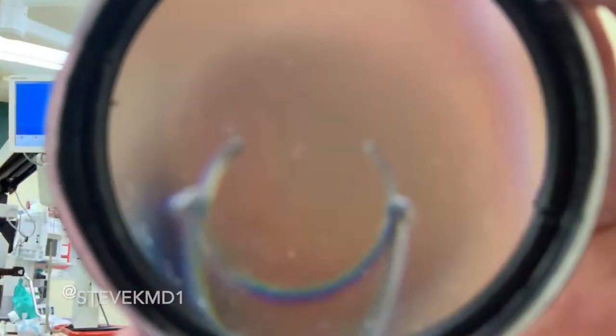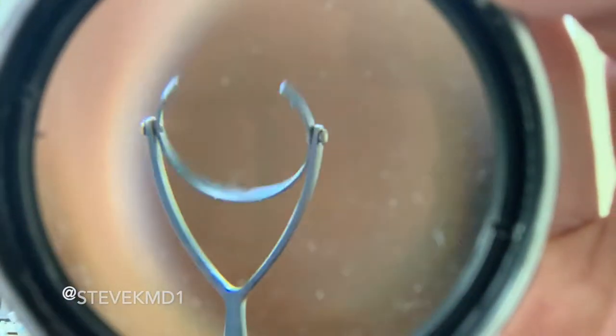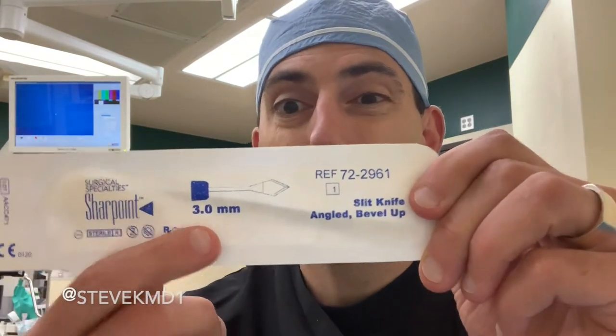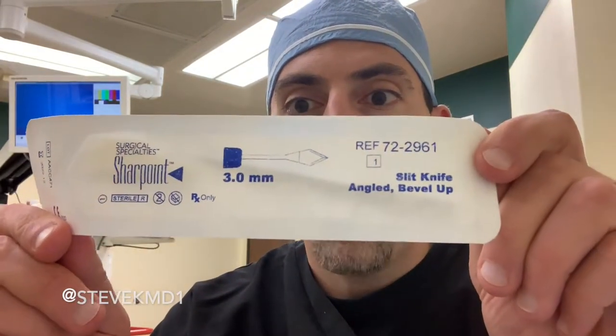Then the very next thing we do is use what we call a stabilization ring, or a Thornton stabilization ring. It's got kind of teeth on it. It doesn't really hurt because the eye is numb, but this stabilization ring holds the eye in place while we make our next incision. The incision we make here is with a main keratome blade — this one is three millimeters. We usually use one about half a millimeter or more smaller than that, so the incision sizes are about one millimeter and about two and a half millimeters, give or take.